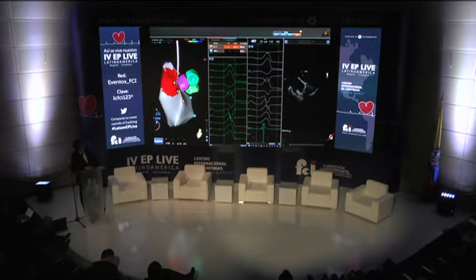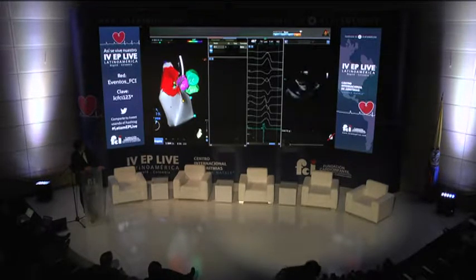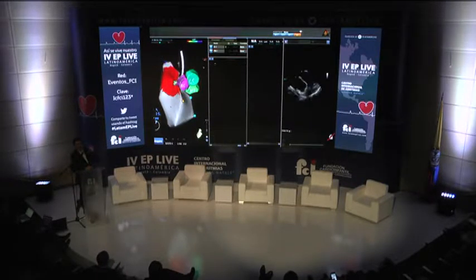Well, the 3 points we have taken from the right coronary cusp, I was seeing more extrasystole being developed. Can we see the right coronary cusp? Here. I would like to have all the points targeting the right coronary cusp. This is what you see here, the right coronary cusp.